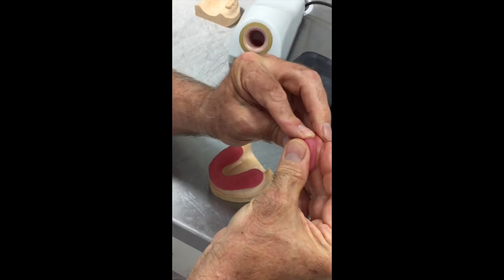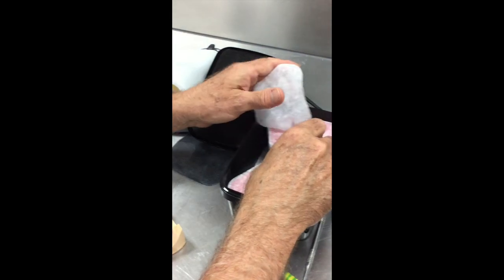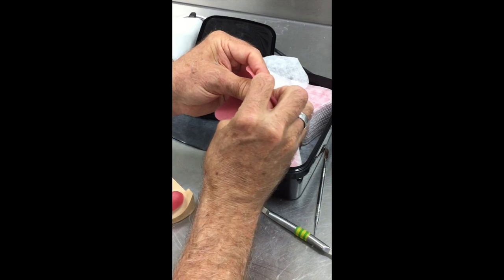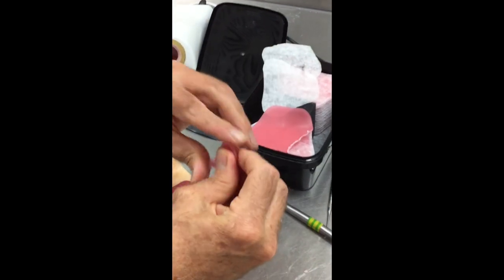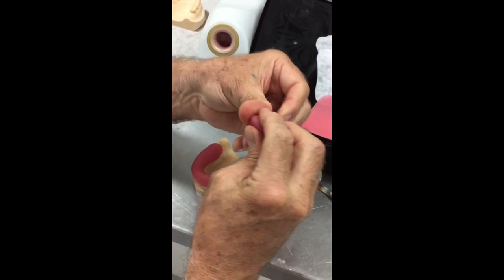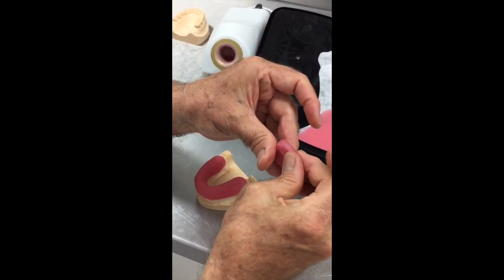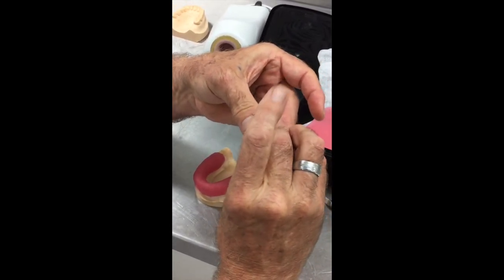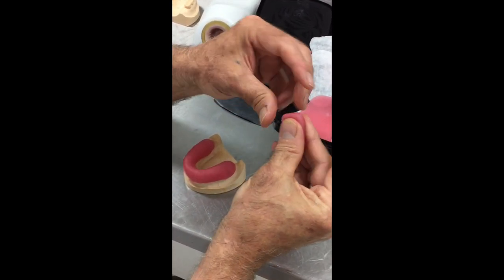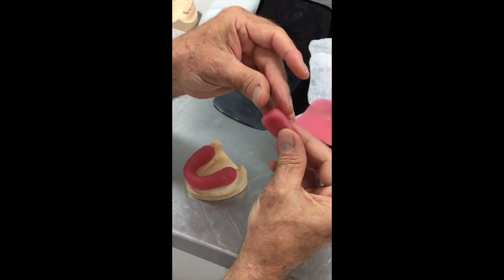Then we have a handle like this. I've got a little bit less than what I would like there, so I am going to take a little bit from another blank and add to this, so that I've got a handle that's a little bit more solid than what we have, and that really depends on the size of the mouth and how much of the arch you're covering with your impression. But we take the handle and we shape it to basically the size that you are used to using. The general rule would be that we would shape it to the size of the thumb, like so. And then we've got it thick at this end here.